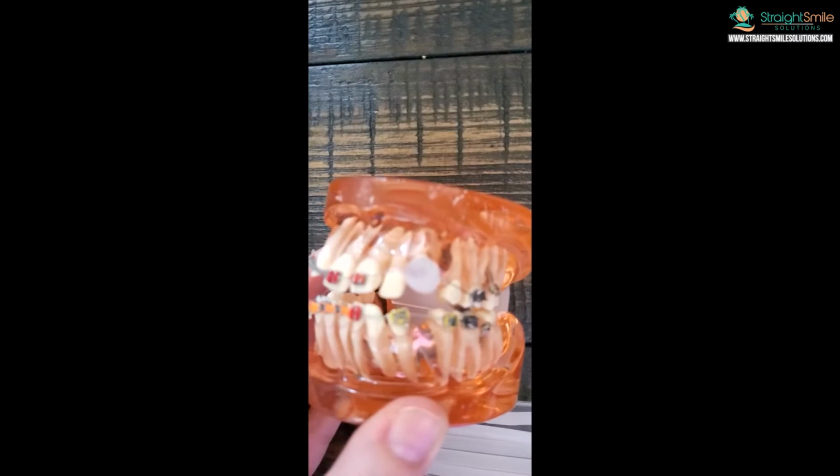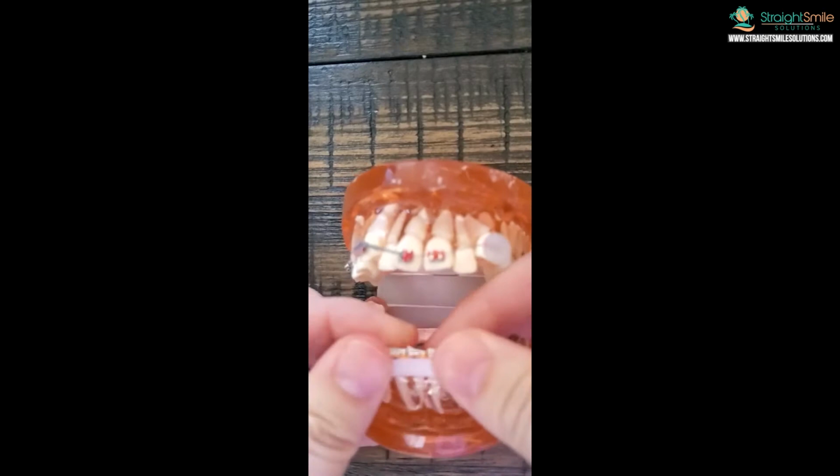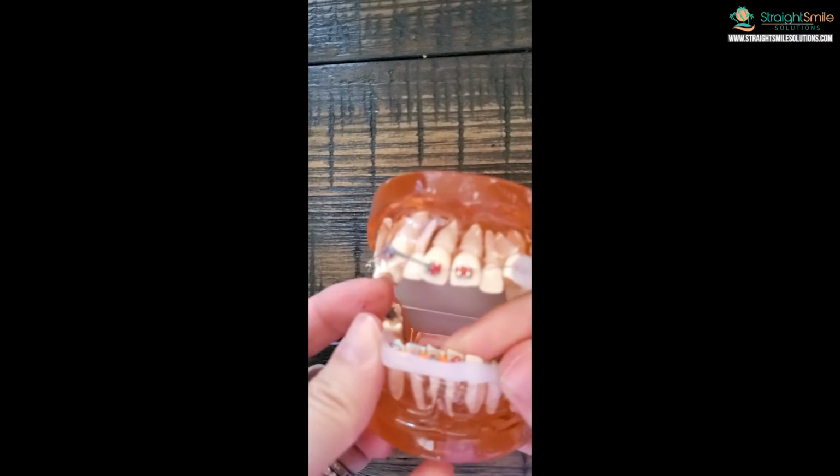I would definitely be very liberal with your wax. And don't get me wrong, I've seen people do this before. Take the whole strip and just press it on. It looks a little junky. But, you know, you got to do what you got to do, especially at nighttime, because that's the time when you get all beat up, when you're sleeping on your face and stuff like that, okay? I mean, that looks bad, but there's nothing wrong with doing that at night.